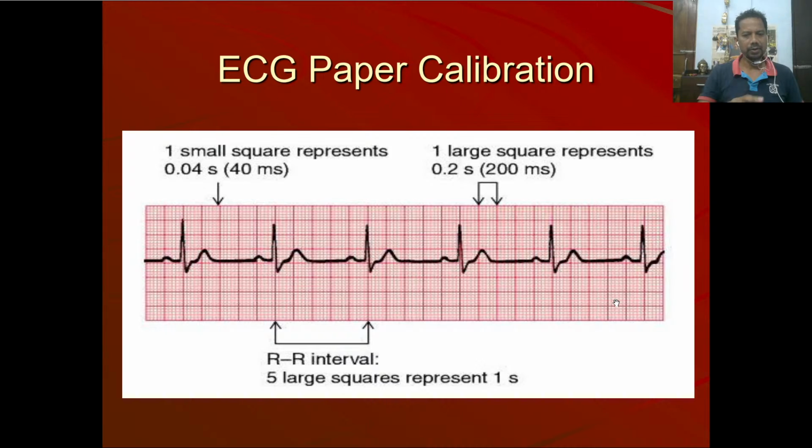If R wave is of good amplitude, T wave has to be of good size, a good positive T wave. If R wave is very tall and T is not tall, T is very small, it could be the subtlest sign of ischemia happening, or T could be flat. In the worst forms, ST will depress and T will invert. So you have to pick up on that. If the T is not of good size and R is of good size, it could mean ischemia.